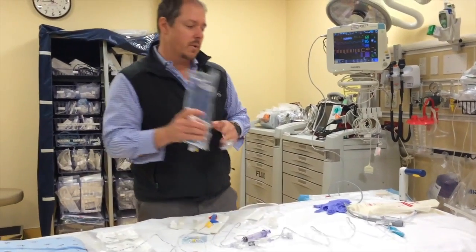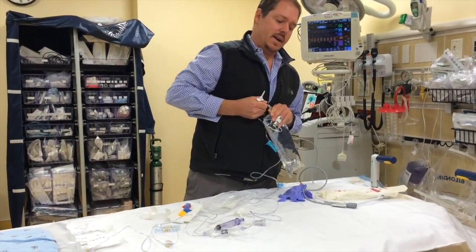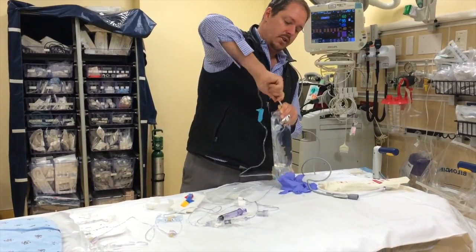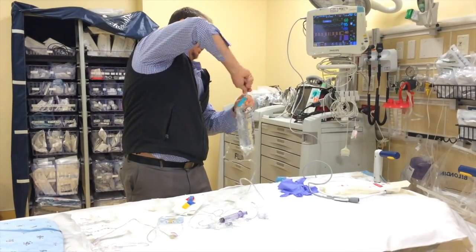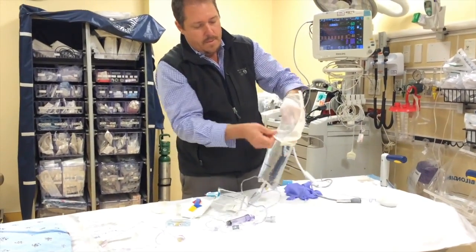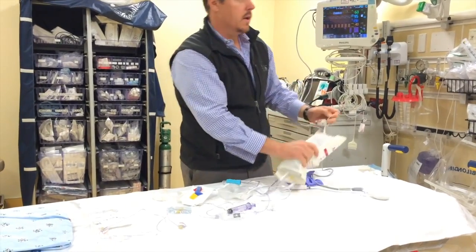Liter bag of normal saline — we're going to do a spike and burp. You can do this a couple of different ways. If we're really in a rush, spike and burp literally looks like spike, unspike, get rid of the air, and then keep on driving. Otherwise, you can hold the bag upside down and burp the air through, though it's a little bit slower. Now we're ready to hang this.